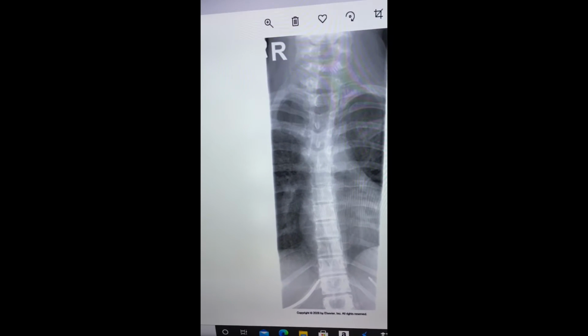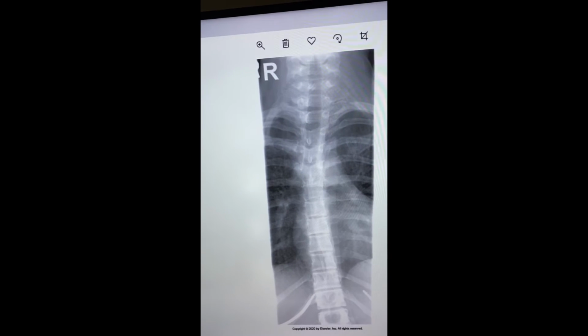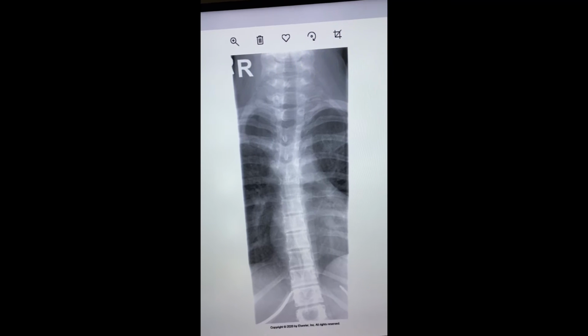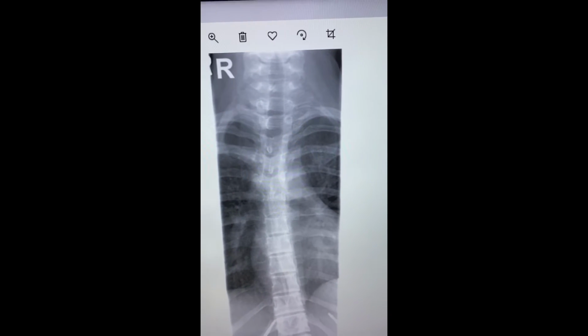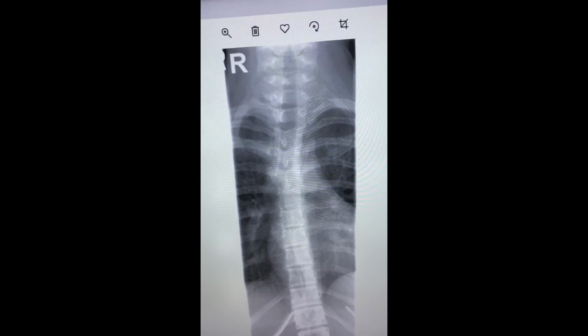Also, collimation: you should keep it from top to bottom open to 17 inches because you're going to be doing this portrait. From side to side, you want about 8 inches from the spine from side to side, and it's opened way too much.